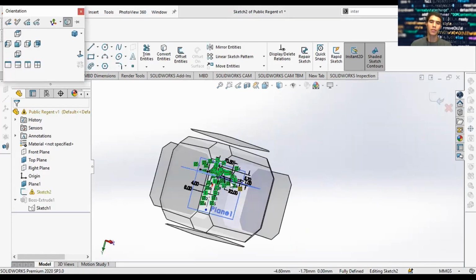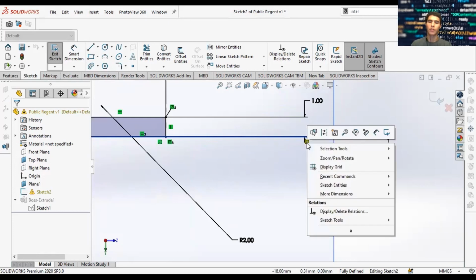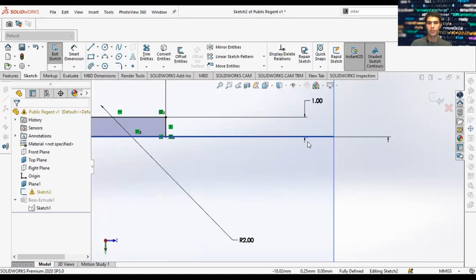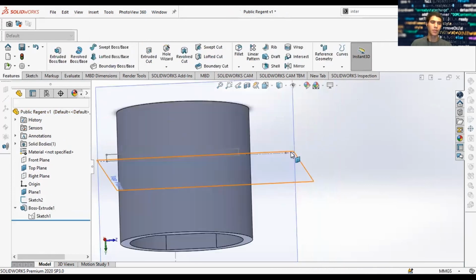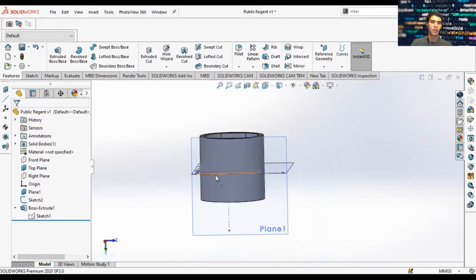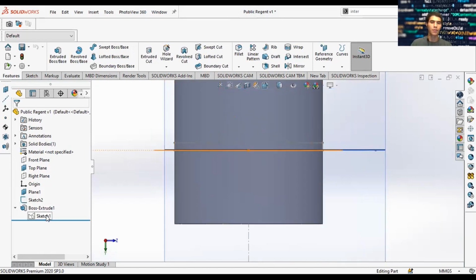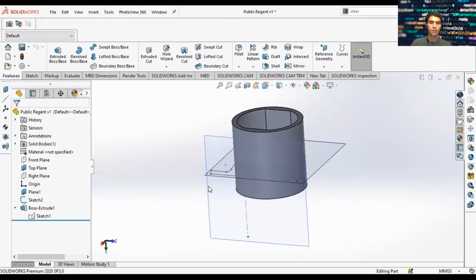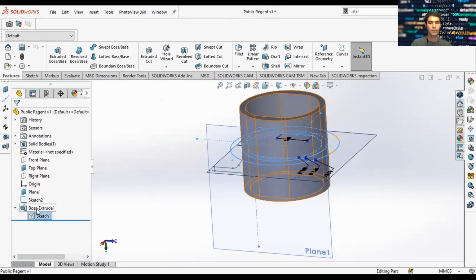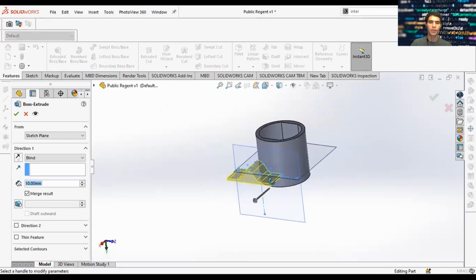Since this sketch is no longer, this particular section here is no longer available. So now I deleted that. That should be good now. There's just one part of the sketch that was changed that affects the whole sketch. But now we can go back and do our extrude again. There we go.